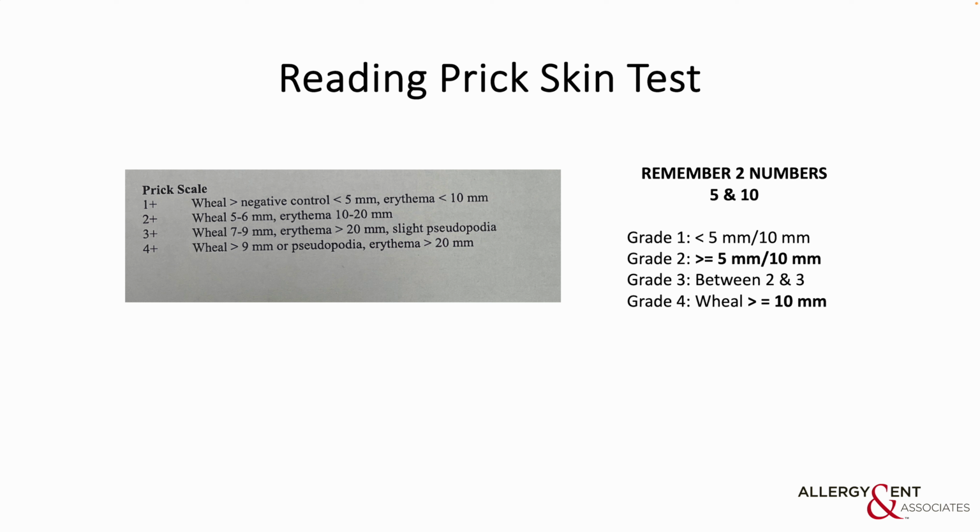For food testing, it's important to know the exact measurement of wheal and flare. Since the provider and parents follow the trend of the skin test for the food, with the hope that the children can outgrow the food allergy, I recommend staff put down the grading for food skin tests and also document and save the exact number of wheal and flare when you measure the food. Again, for grade 3, if you overread or underread a little and call it a 2 or a 4, it's okay too, because it's still a positive test.